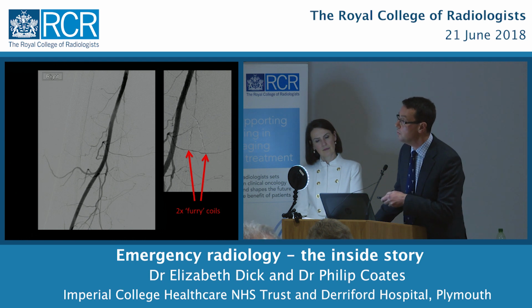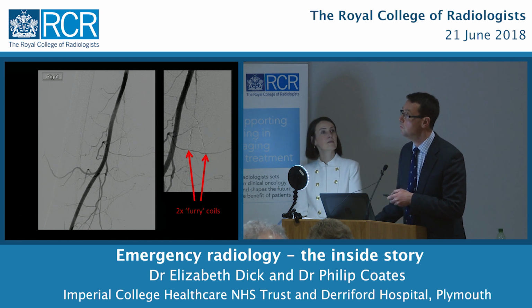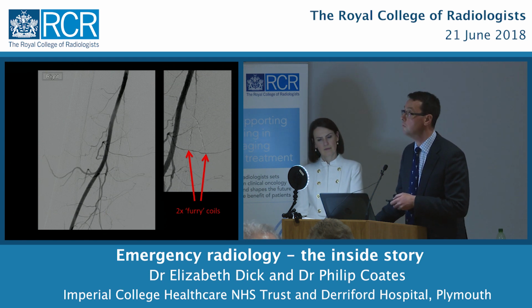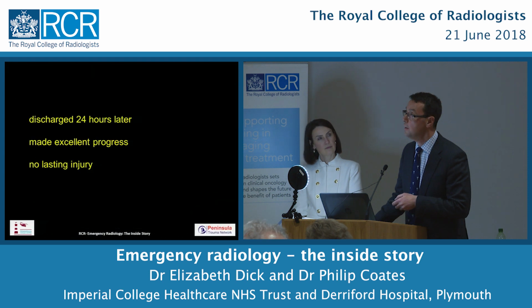I put furry coils because they're platinum coils with polyester and things sewn onto the outside to give them a large surface area for clot to form. Again, a nice neat treatment for this patient. It's avoided an operation and a prolonged hospital stay, prompt and effective hemorrhage control in his case, and it stopped the hematoma enlarging and potentially him losing his leg without hemorrhage control. He went home 24 hours later and made excellent progress with no lasting injury.